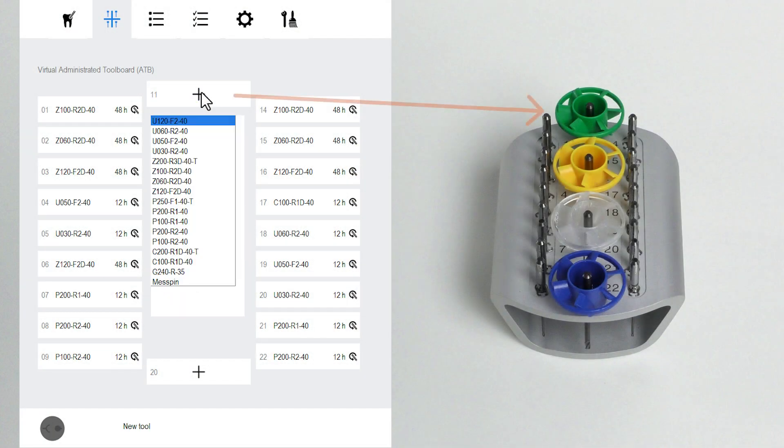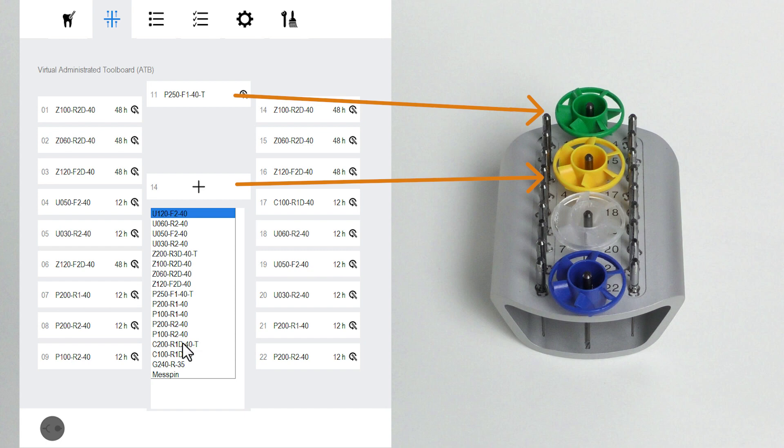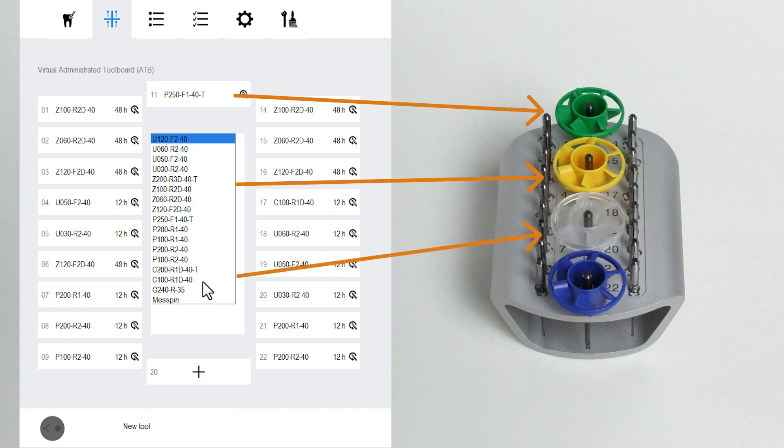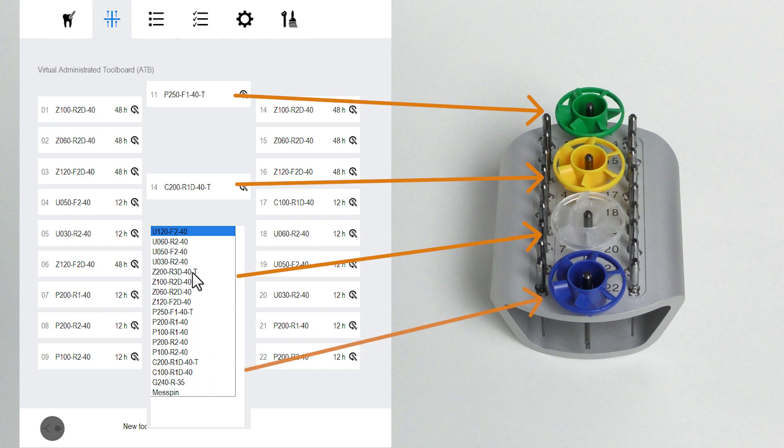The virtual ATB in Dental CNC maps the structure of the physical ATB. Clearly assigning physical and virtual tools lets you easily track tool lives in Dental CNC.